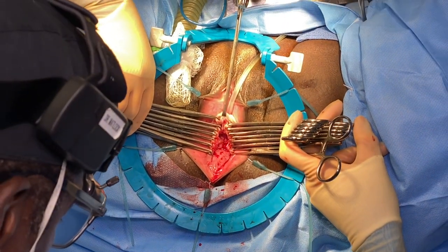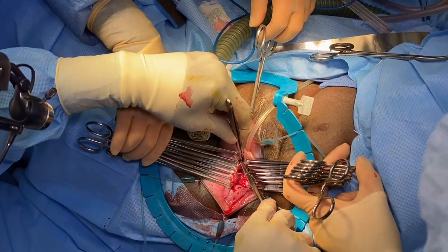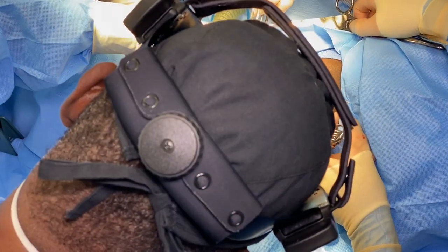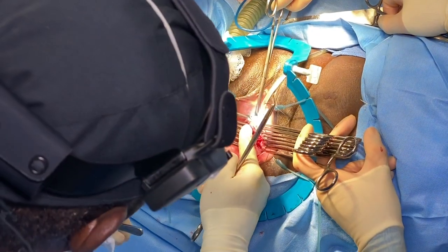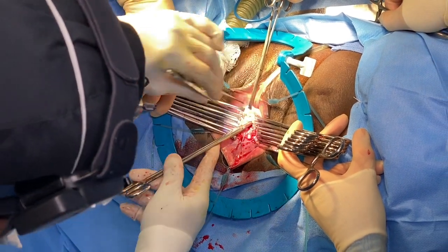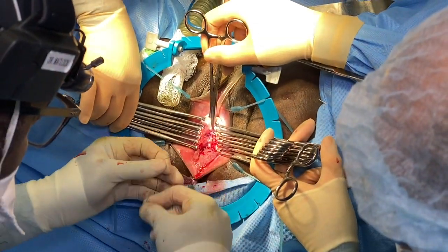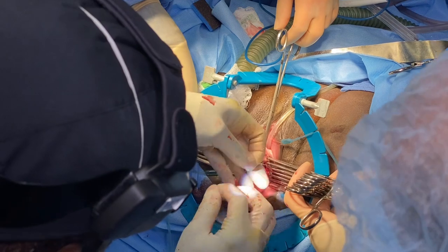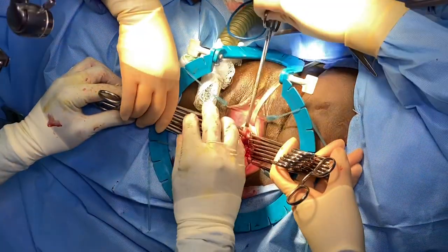bringing the fascia back together. It'd be easier if you just think about it as muscle, bringing the muscle back together. Think of a tummy tuck as an analogy. Now, along the urethra, if you feel that, okay. We're going to walk up along the urethra here. We're going to bring you back in.